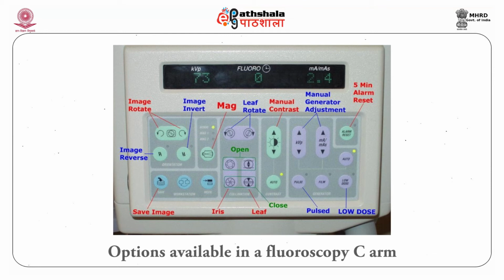There is also a 5-minute alarm reset button. This is an integrated timer to warn the interventionist or the orthopedic surgeon regarding high doses going to the patient.